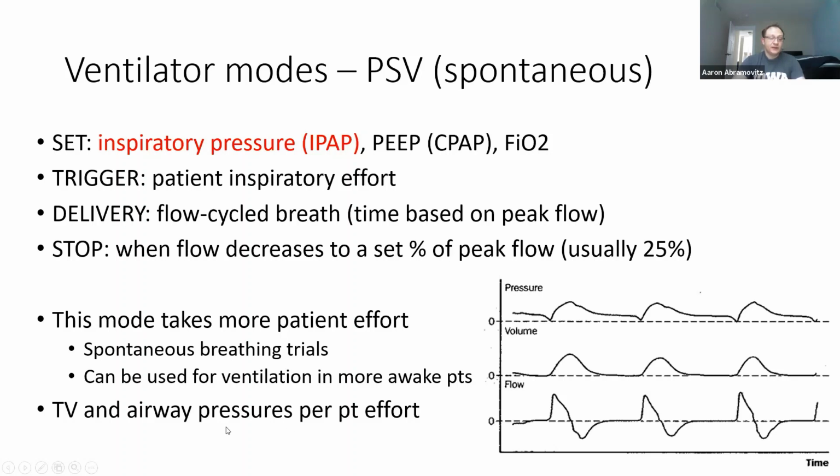And for the tidal volume and airway pressures, there's a minimum from the IPAP set, but patient effort really helps dictate the tidal volume and airway pressures. And generally, the support settings we use for PSV are pretty low, so the patient's effort will really do most of the work in terms of generating a minute ventilation.